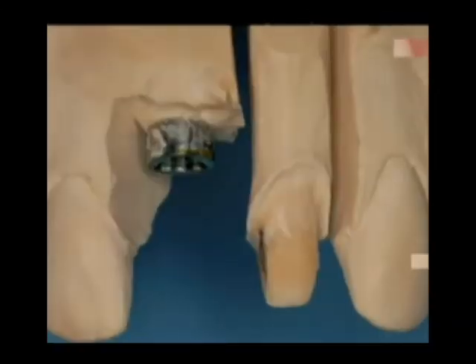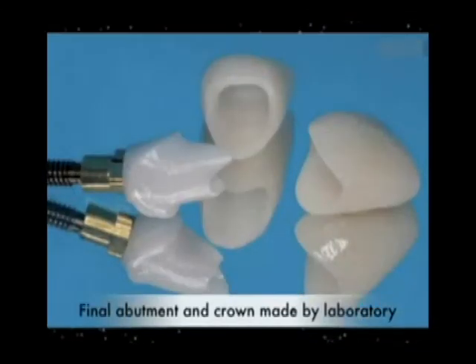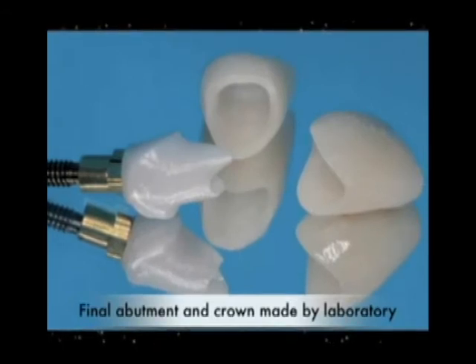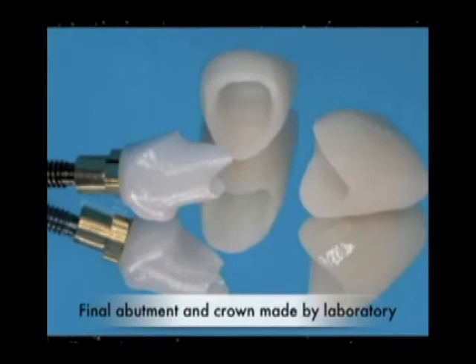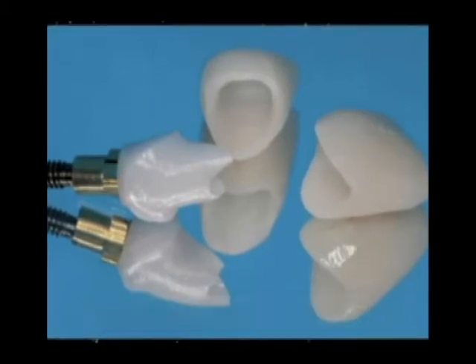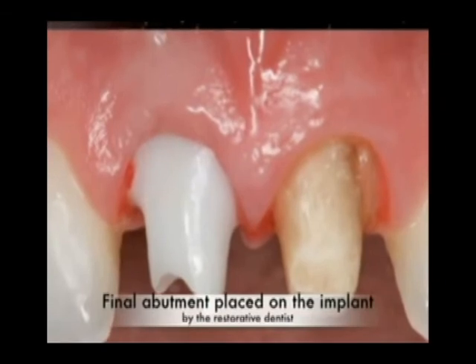And then we go through a series of technical measurements and impressions to make the laboratory components for the crown and the implant. We receive them back from the laboratory, again, painlessly, now without anesthesia because there are no nerves.